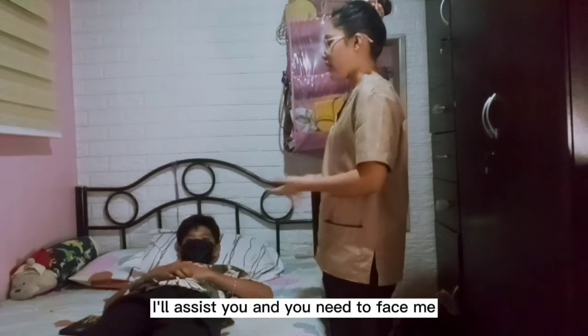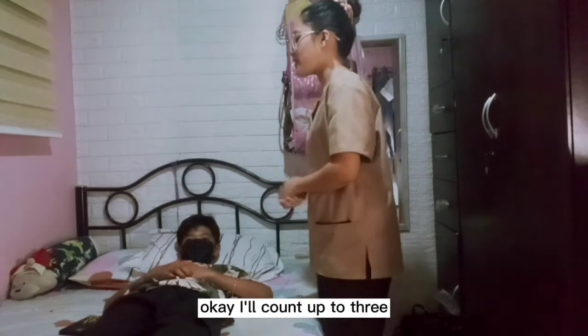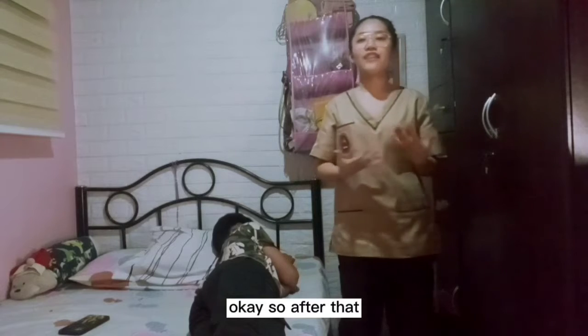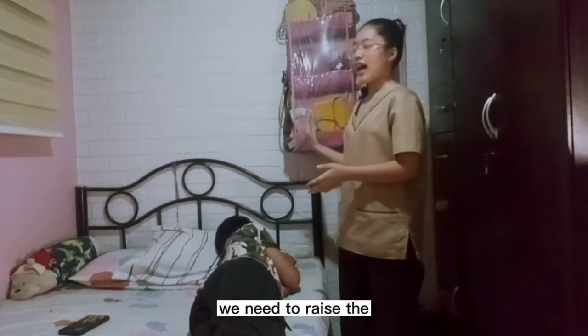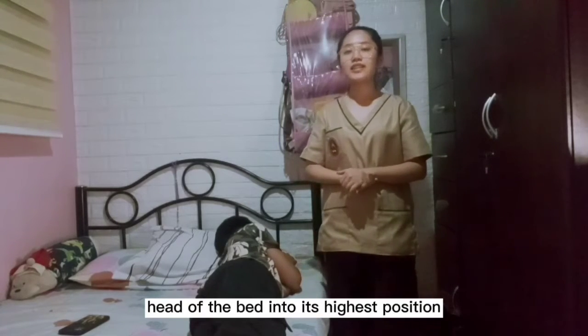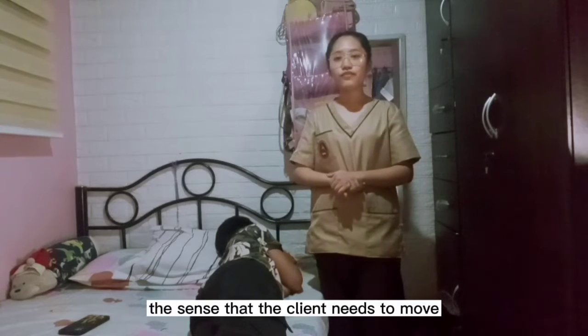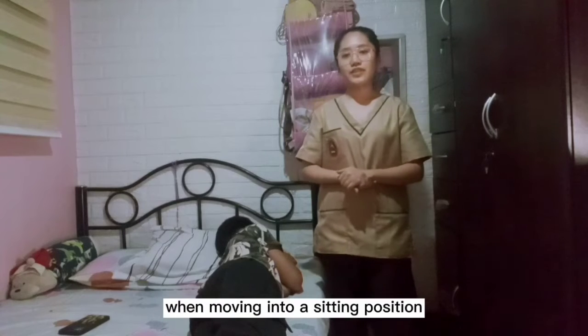I'll assist you and you need to face me, okay? I'll count up to 3. 1, 2, 3. Okay, so after that, we need to raise the head of the bed into its highest position because this will decrease the distance that the client needs to move when moving into a sitting position.